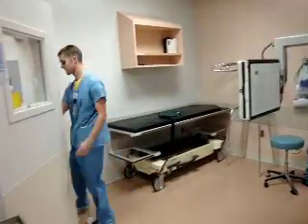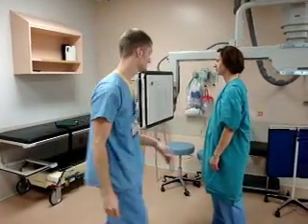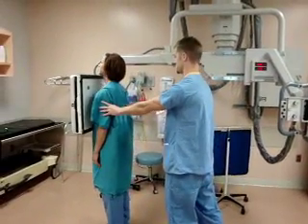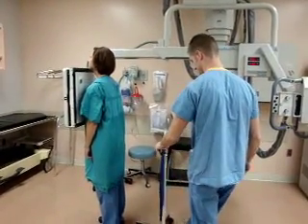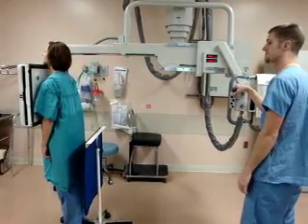Everything is okay so we will start. We place a film in our upright bucky and we put the patient face first and center them — and that is a lead shield to protect them.